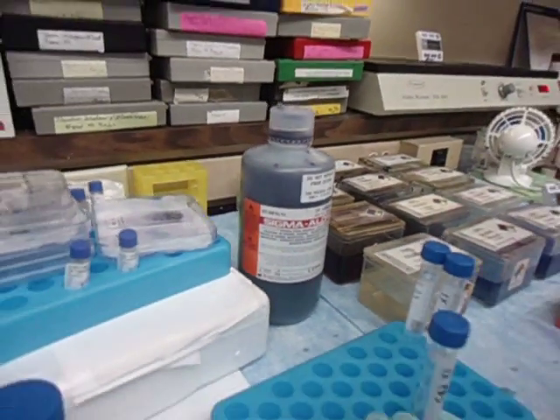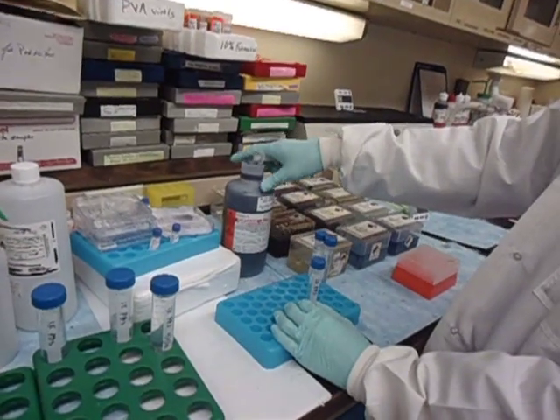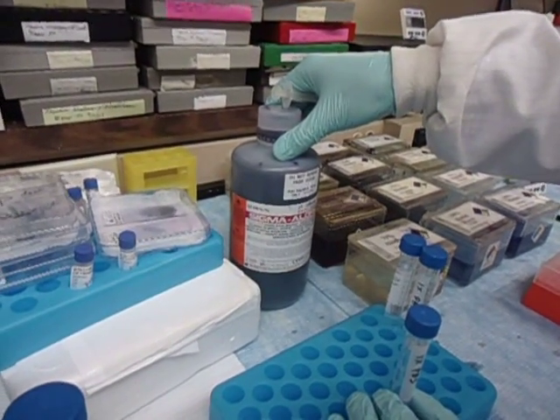Okay, so now I'm showing you the staining part of the procedure. Over here we'll be using the Sigma-Aldrich Giemsa stain.